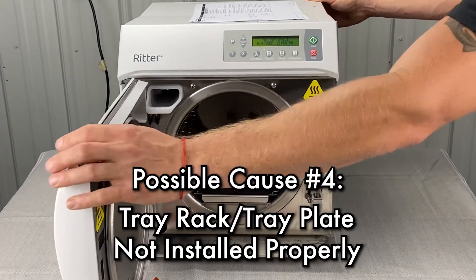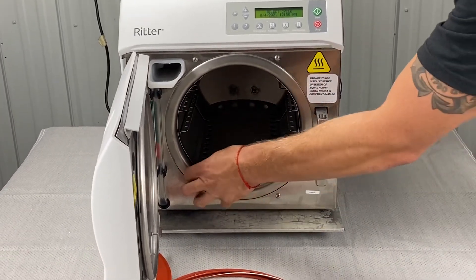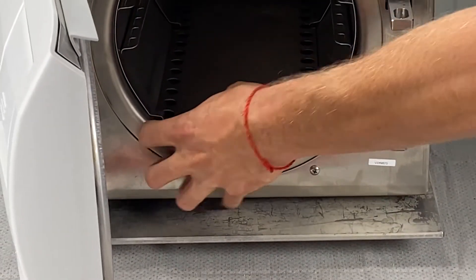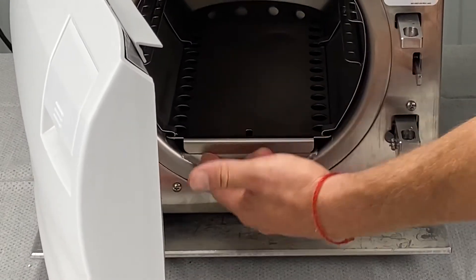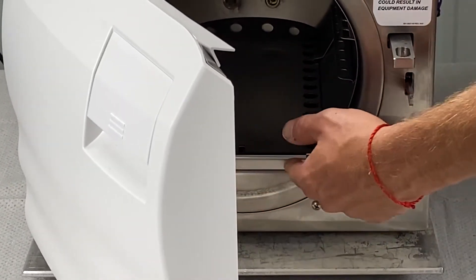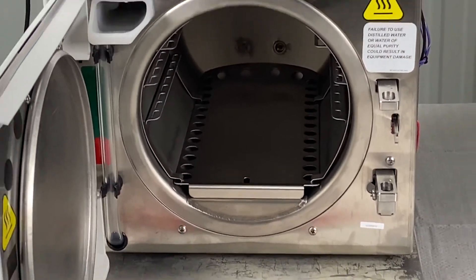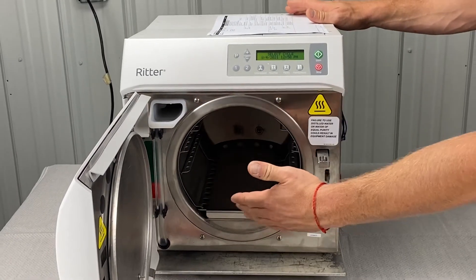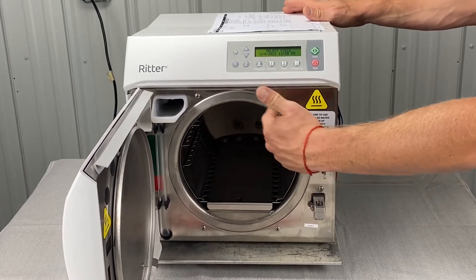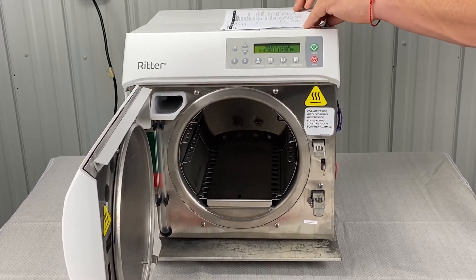The tray rack and plate not being installed properly is another cause. If it's sitting out a little bit too far and hanging over the front lip, that could cause issues. You want to make sure it's set back maybe an eighth of an inch inside of the chamber. Anytime we find an issue that may have been the cause, run a new cycle and see if the error persists.